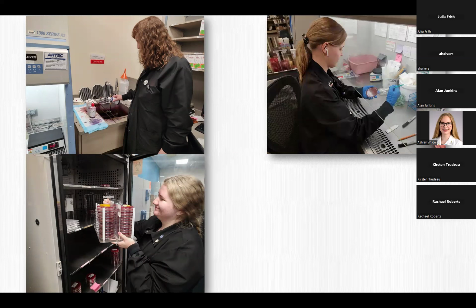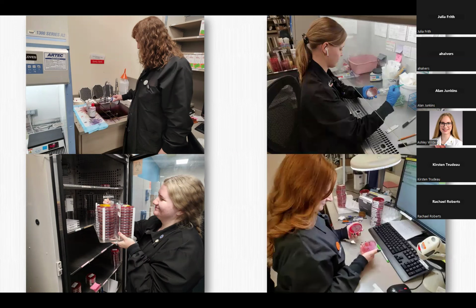And then once a day, we would take those plates out, and somebody like Nicole here would look at those plates and figure out what we needed to do to work up those cultures. Then when she was done looking at those cultures, we put them in a rack and we put them back in the incubator, and we wouldn't look at them again until the next day. And that's the way microbiology was always done.